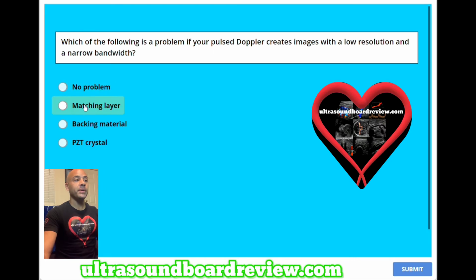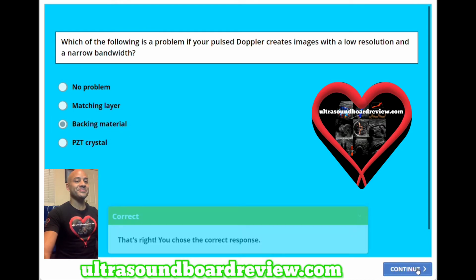A, no problem, B, matching layer, C, backing material, or D, PZT crystal? The answer is C, backing material.